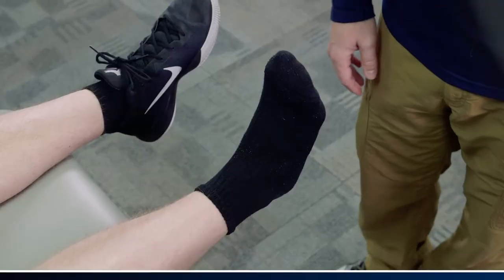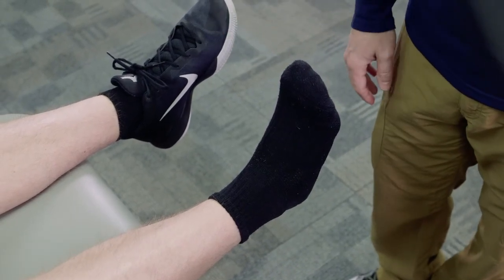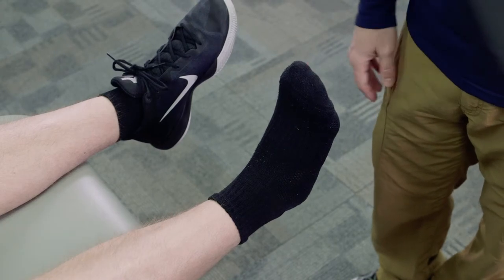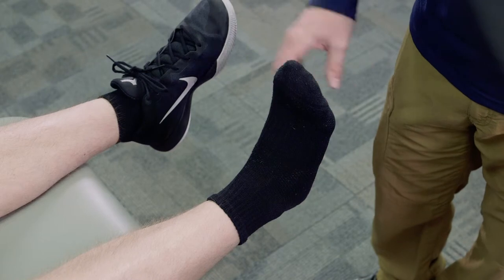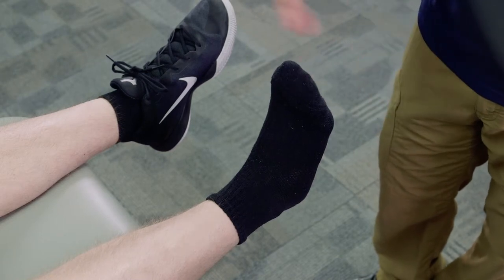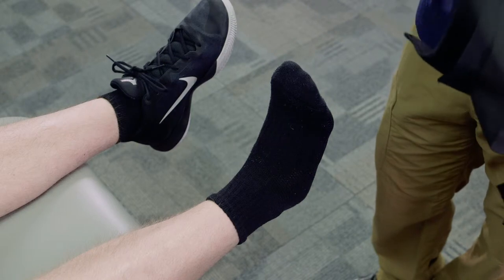You want to make sure you have the right size and that it's fit appropriately. The first thing in sizing the brace is to make sure the athlete is in a seated, relaxed, comfortable position with their leg extending off the table in what we call a neutral or dorsiflexed position. This allows us to simulate when they're standing on it.